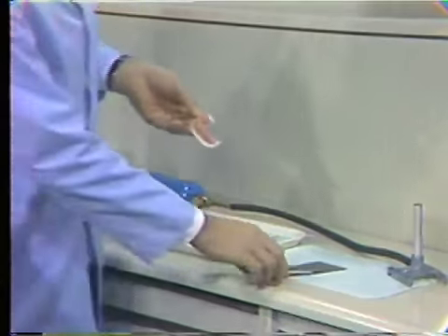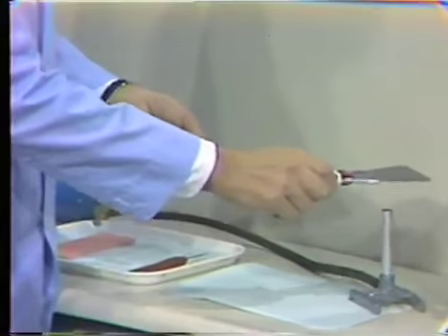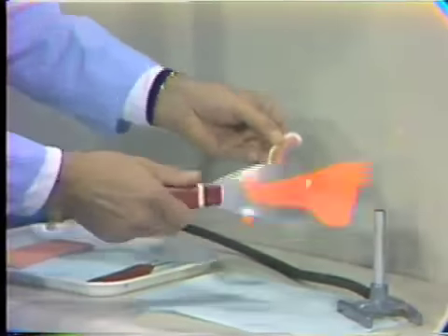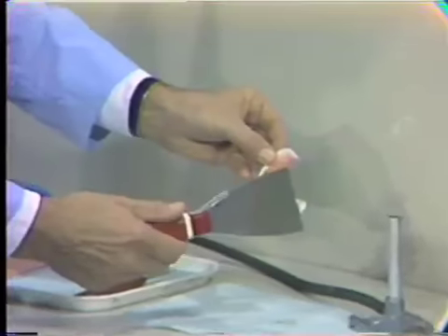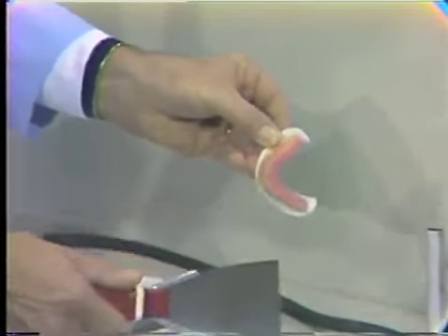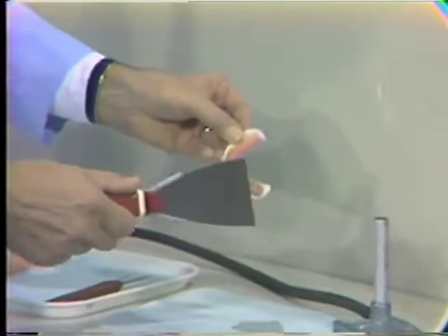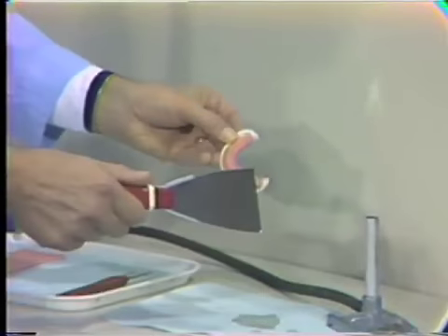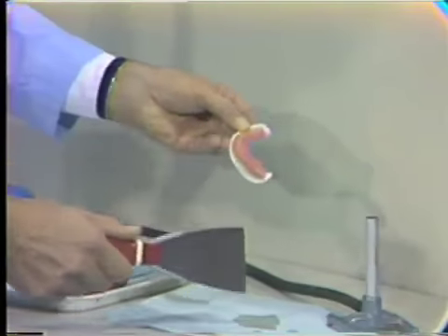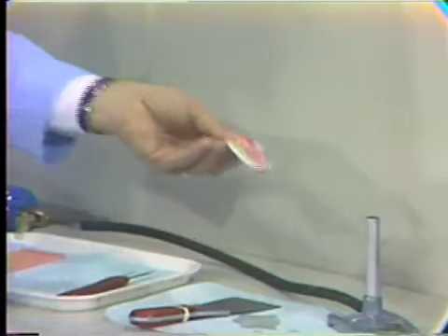For this purpose, we'll use the putty knife, a flat, heavy surface that can absorb a lot of heat, and with this we can equally remove any excess wax. And we were attempting to remove a couple of millimeters, yet keep this flat and in the same relative relationship to our retromolar pads. This appears to be approximately correct. We'll now return to our patient and check it.